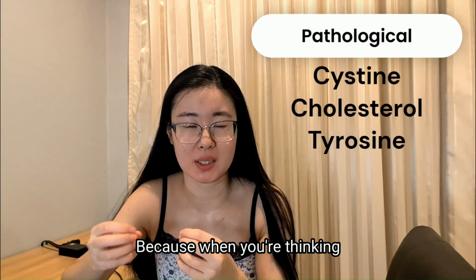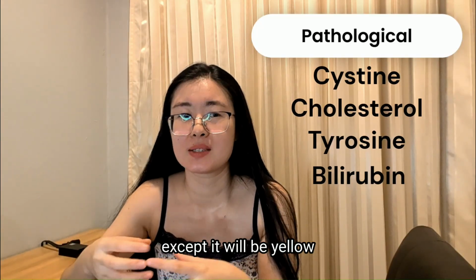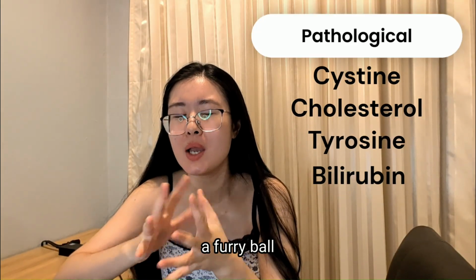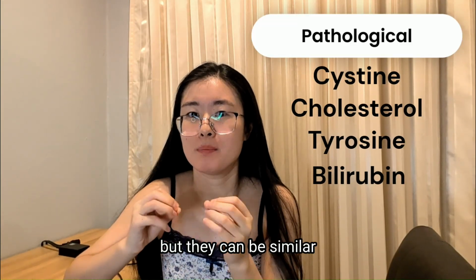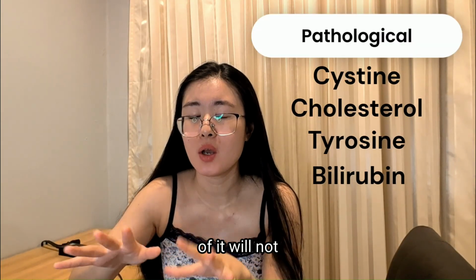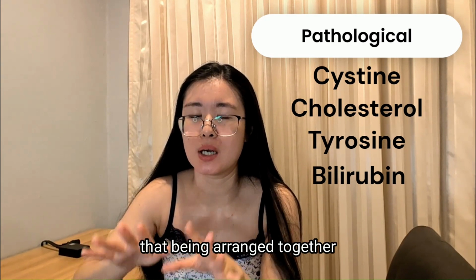So why do I mention that? Because when you're thinking about liver disease, the other crystal is called bilirubin. It also looks like a needle bundle, except it will be yellow. And this needle bundle looks more like a furry ball. It's not as perfectly arranged as tyrosine, but they can be very similar. But bilirubin will have color and the needle shape of it will not be as clear as tyrosine. Tyrosine will absolutely look like steel needles arranged together.